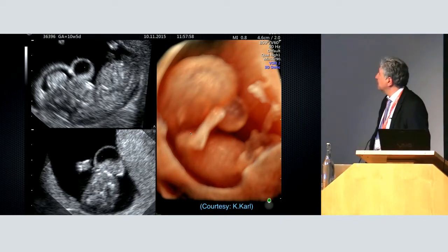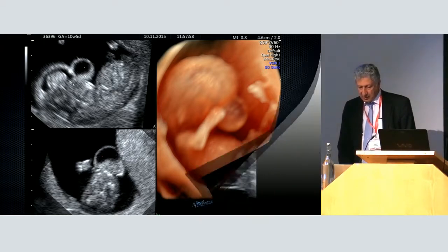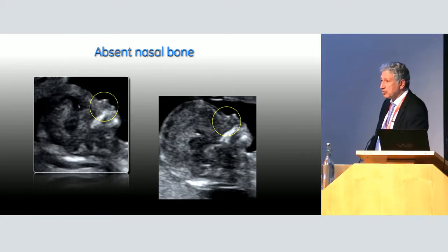This is a rare case, given to me at 10 weeks. We see the anterior cephalocele, and this is something where, if you try to look at the face, you will see it obviously, as early as even earlier than 10 weeks. I will not discuss the nasal bone. Katya did it very nicely 2 days ago.